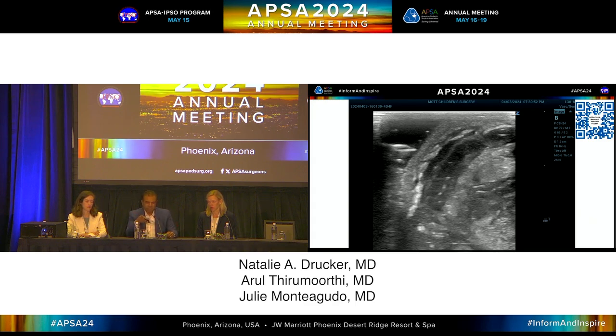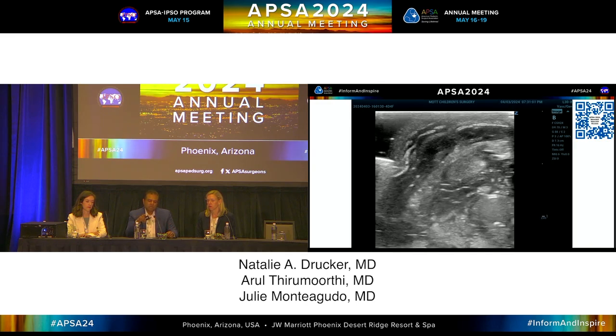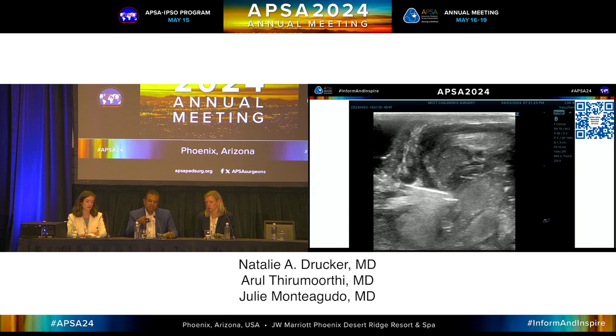So you can see where the needle is, and you can see that's actually a pad of gel, and that's what those little white specks are showing us. And you need to see your needle passing through that gel before it enters the skin so that you know you're not compressing. And then we can see where the SCM is. In this case, we're going through the SCM. I usually try to go lateral. It's easier to pass a tunneled catheter, but then we're getting set up. Now here, we're coming through the skin. We're starting to distort, and so first coming in under the SCM. Now here, we're under the SCM and coming right into the IJ, and this is with everything in line, okay?